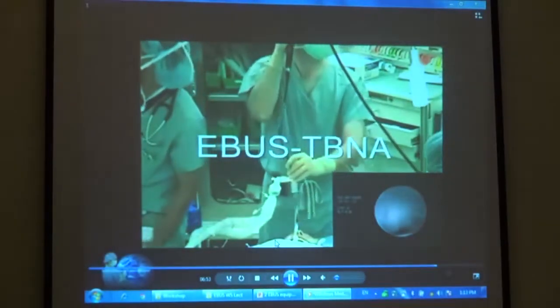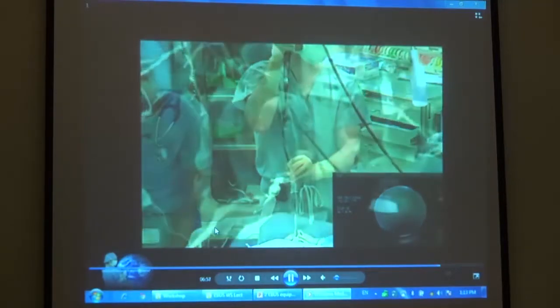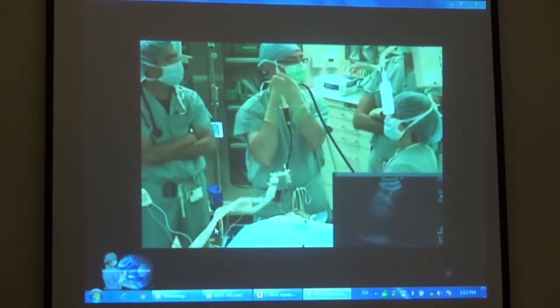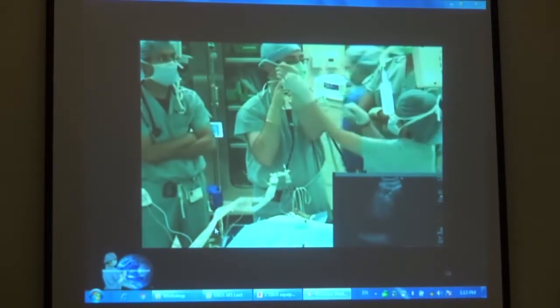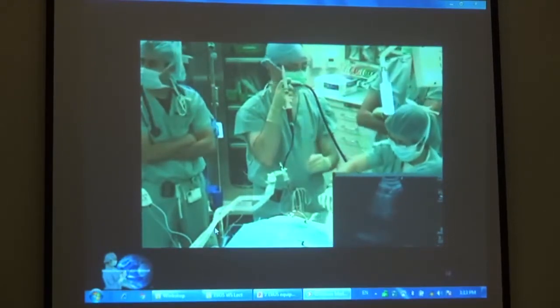In this instructional video, we described the basic principles and steps for performing EBUS TBNA using a dedicated EBUS bronchoscope with a 7.5 MHz linear array transducer. Currently available technologies allow frequency changes and directional Doppler capabilities that further enhance image acquisition.